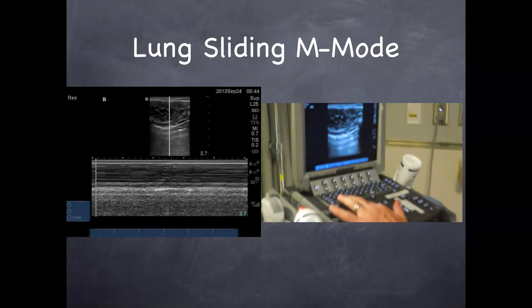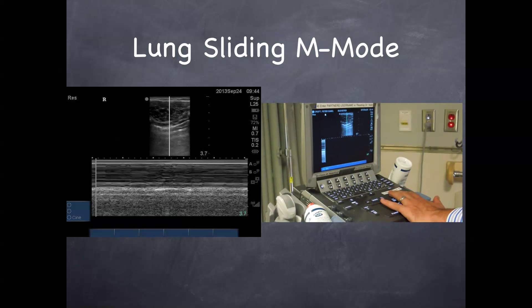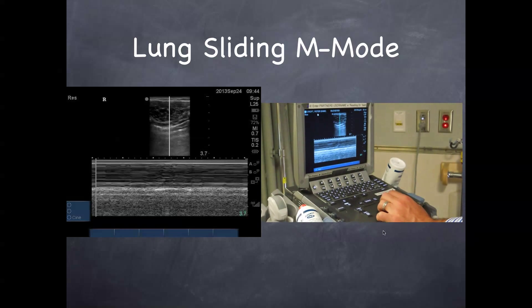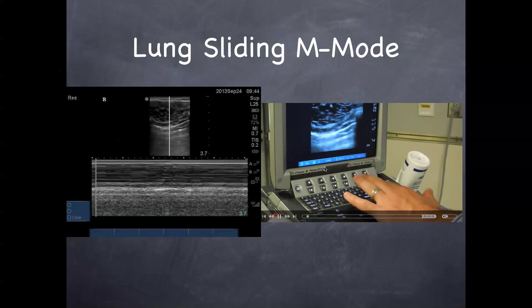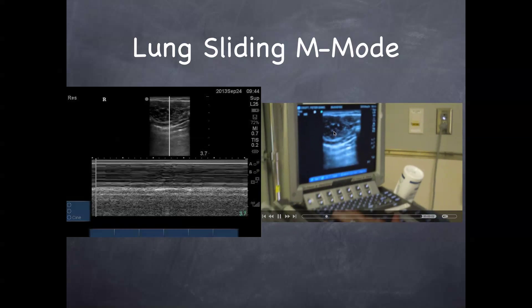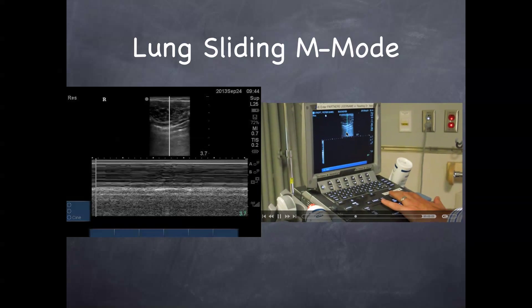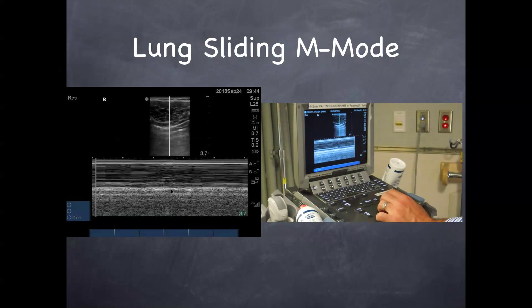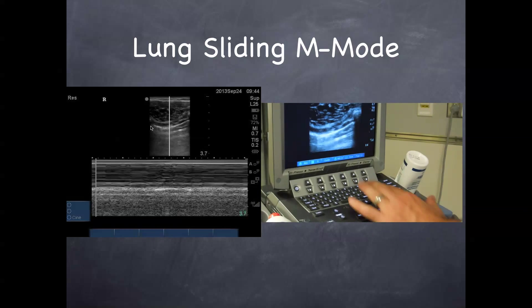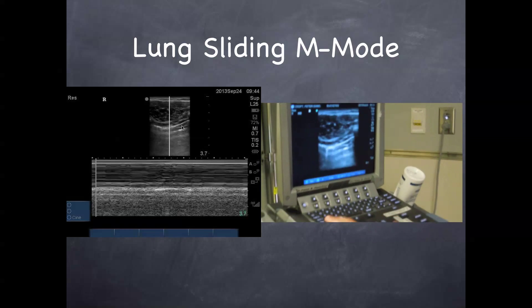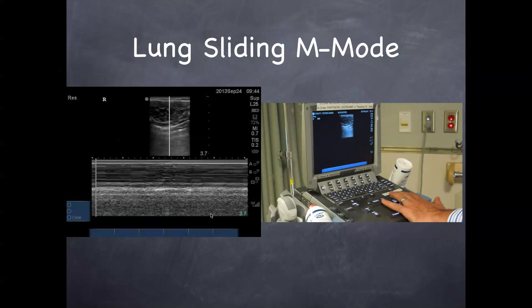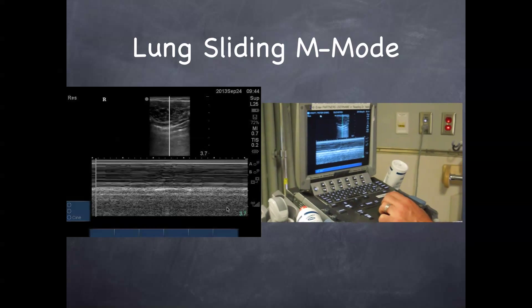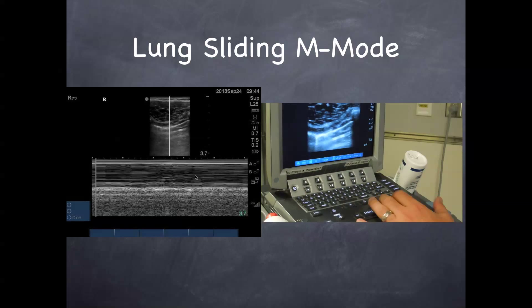If you want to confirm with M mode, click M mode. Here's Scott doing this on the machine, clicking M mode, getting his vertical line where he wants it. That vertical line corresponds to the B mode image. As you can see, the pleural line is here on M mode and here in B mode. 3.7 corresponds to 3.7, so every structure here corresponds to a structure there. This is called your seashore sign because it looks like a beach with waves coming in.